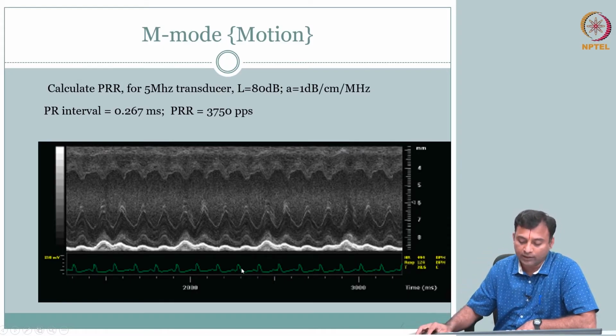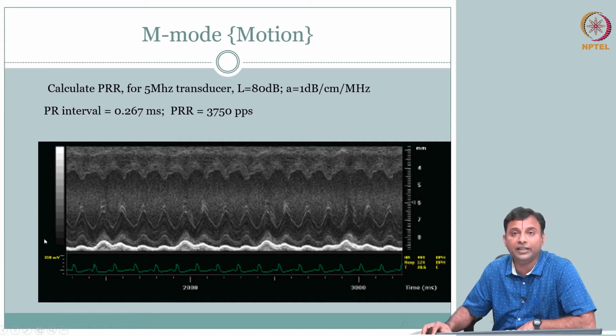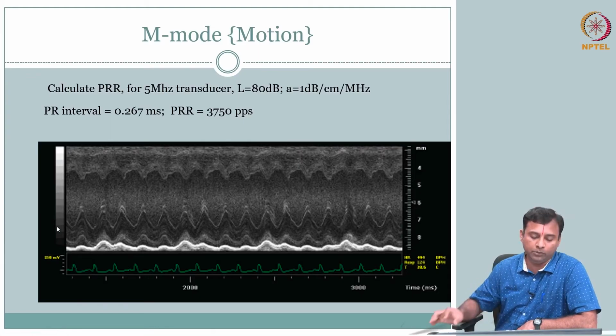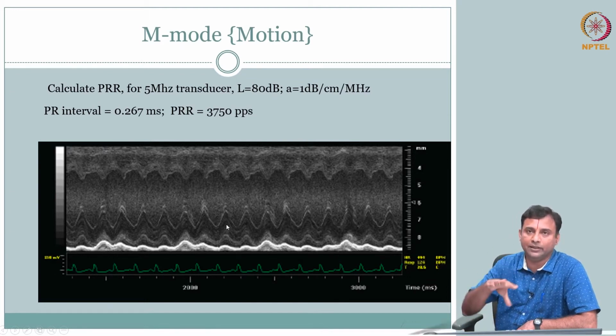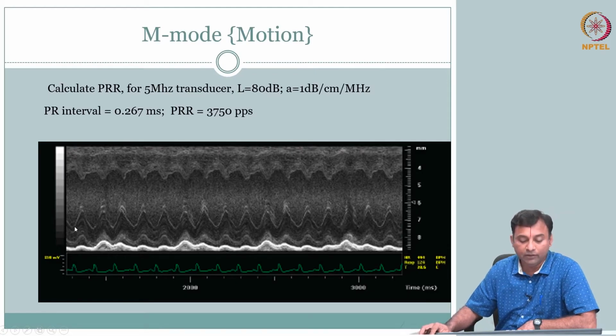So, this is your ECG, right. So, you can essentially look at this and say, look, you can actually get very powerful information, even though it is just amplitude at one location you are keeping, you are just plotting it as a function of time. Your A line as a function of time, different pulses, you are just stacking next to each other. This itself tells you the whole range of motion of the tissue that is opening and closing. You can get that information.